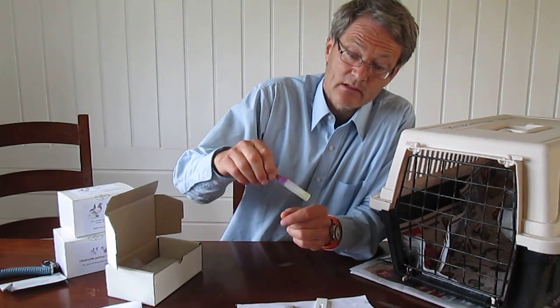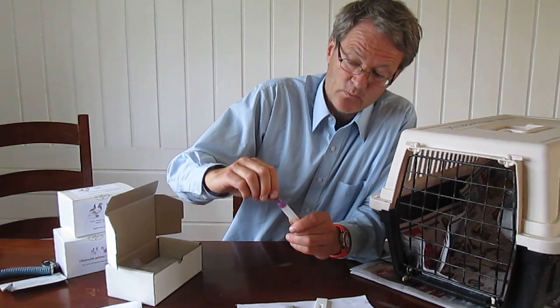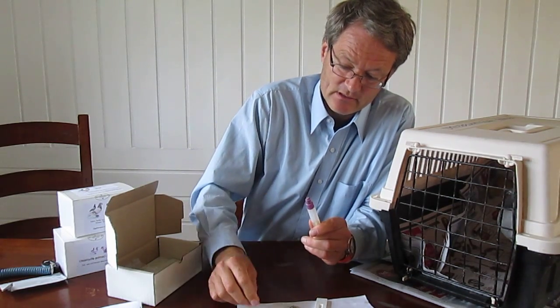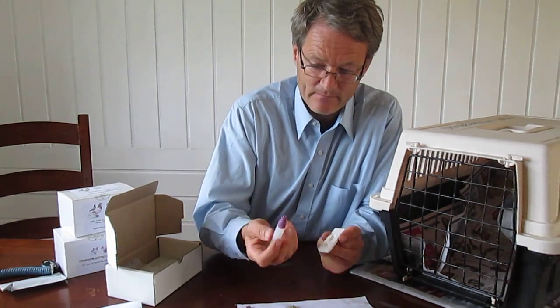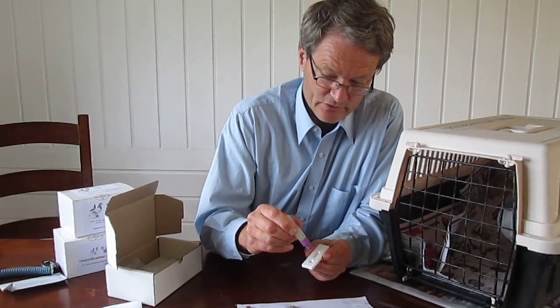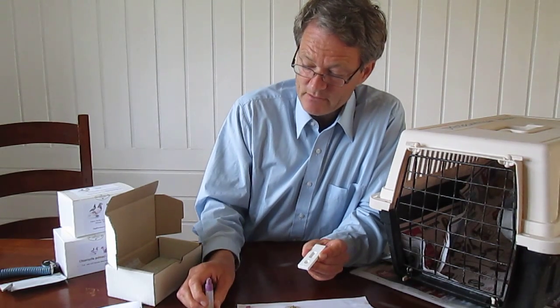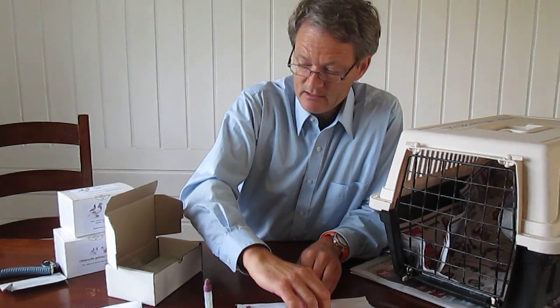Now we have shaken this up — it's a blend of a bit of dropping from the pigeon and the liquid. We can open up this little bottle like that. There is a filter inside, and we place three or four drops into the round hole: one, two, three. Now we just need to wait a few minutes.